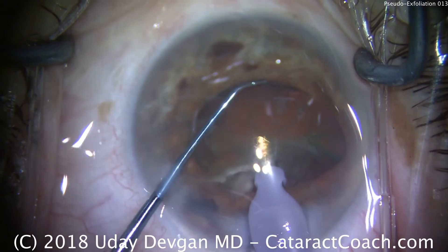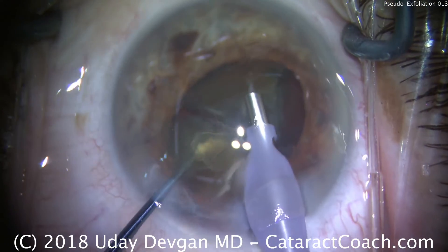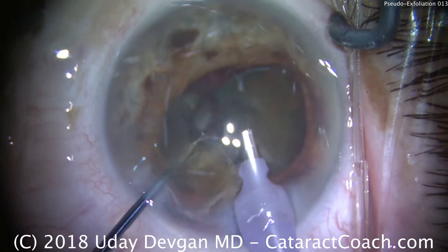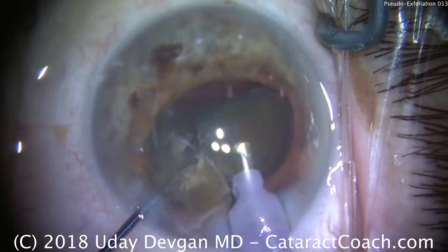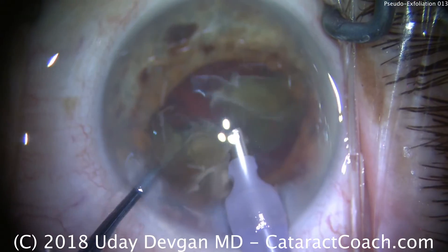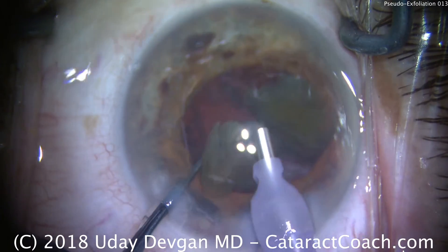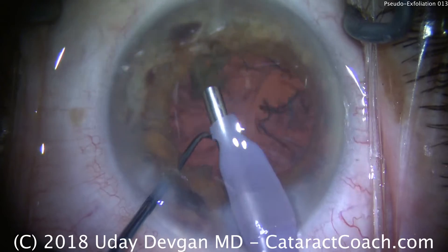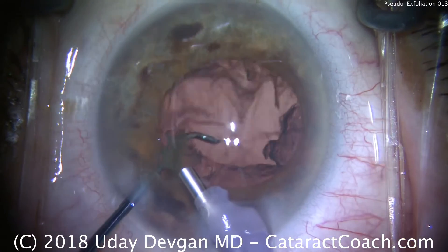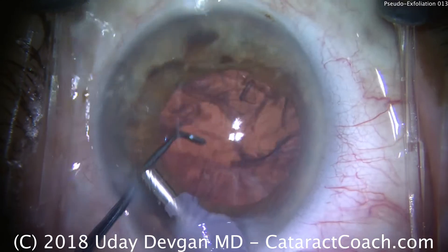Buzz into the other half, and here we can sub-chop into two quarters. There's a little bit more room in the eye. Keeping the pieces at our phaco tip, we can slowly apply phaco energy. Here we go — last couple of pieces. Note the chopper's in the safety position to prevent the posterior capsule from coming forward. We'll keep the chopper there just to be sure. Here's the last little piece of nucleus to be removed. That looks pretty good.